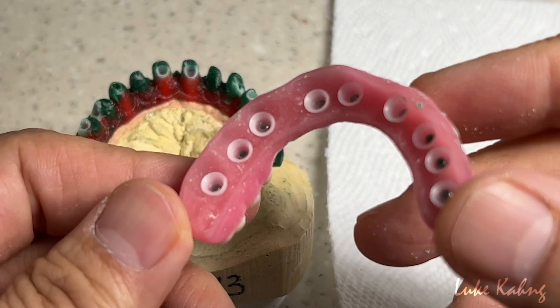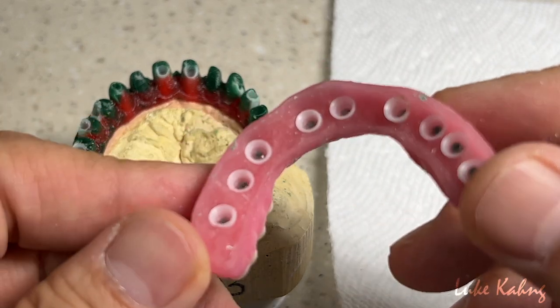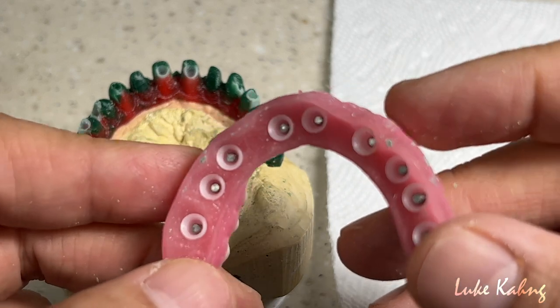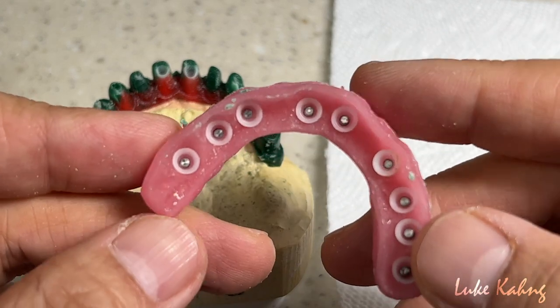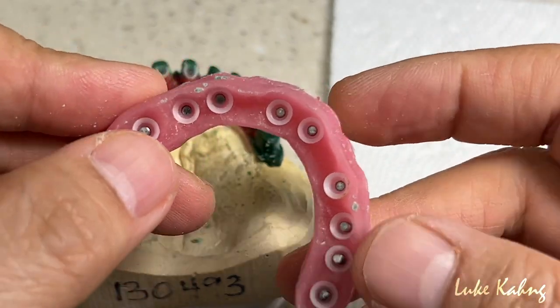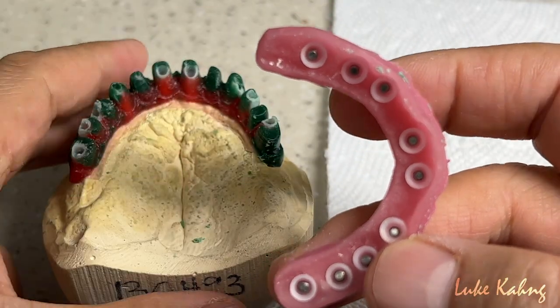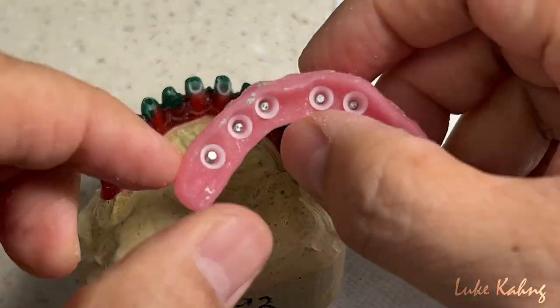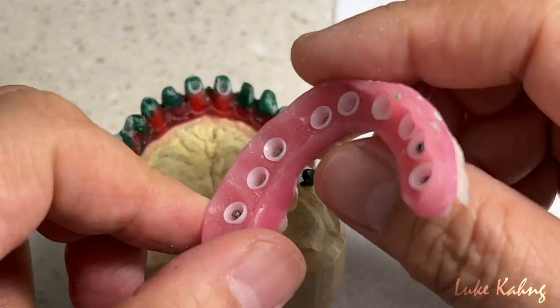There's another really old implant — cannot find it. We have to do UCLA because we cannot find the scan body, so you cannot design it digitally. So what we do is use the plastic sleeve, just like here, and carefully fit it into that area.